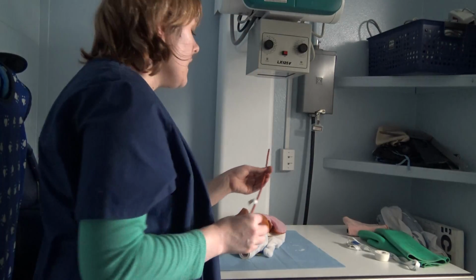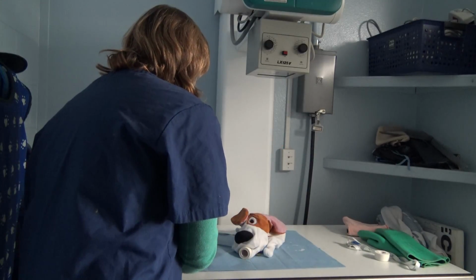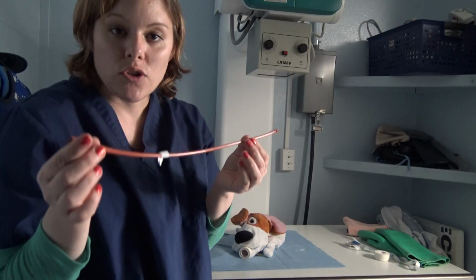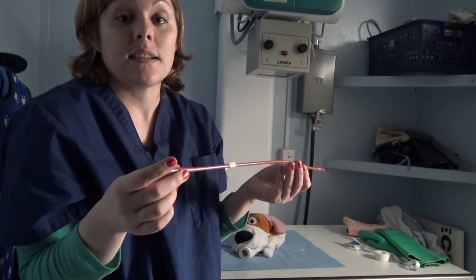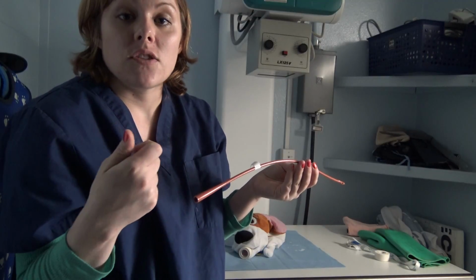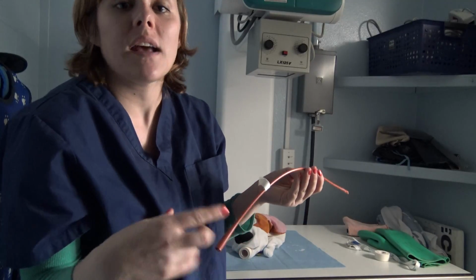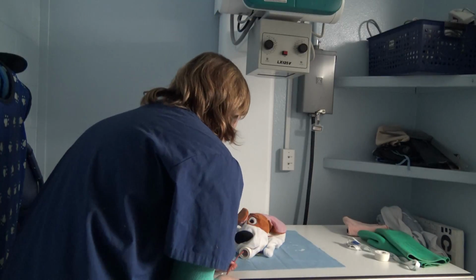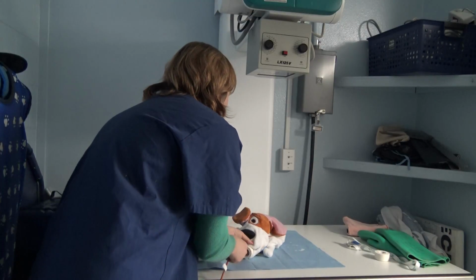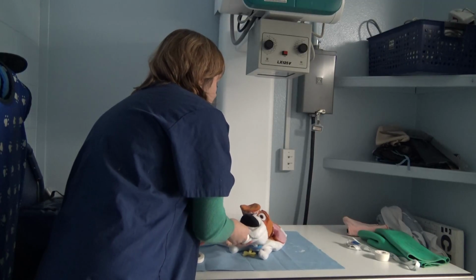And then we'll go ahead and place our stomach tube. Again, once the gag is in, you want to lube up the end of the tube. Make sure you're slowly inserting it, and then we'll go ahead and test that it's in place. When you're administering the couple mils of water, if they cough, you know it's in the lungs. Sometimes you can also test with negative pressure and so forth to see if you're in the stomach. So we're going to go ahead and thread our stomach tube into our patient.